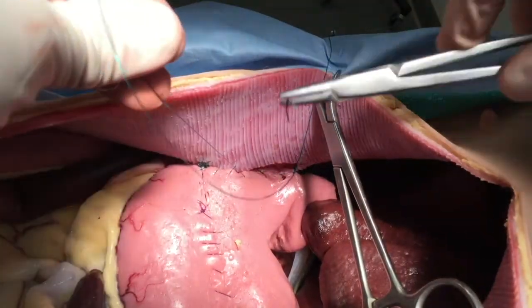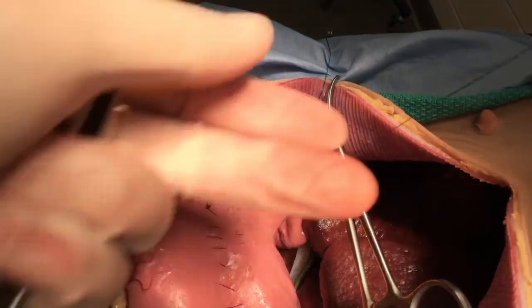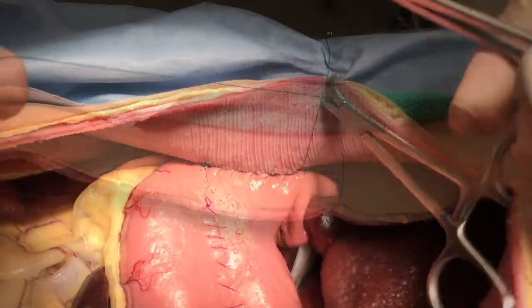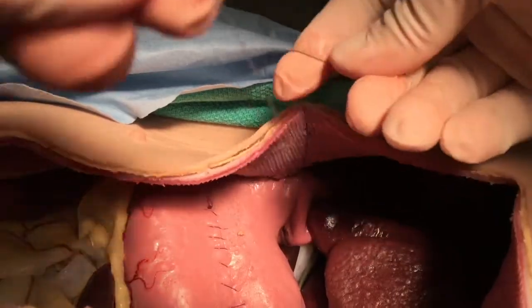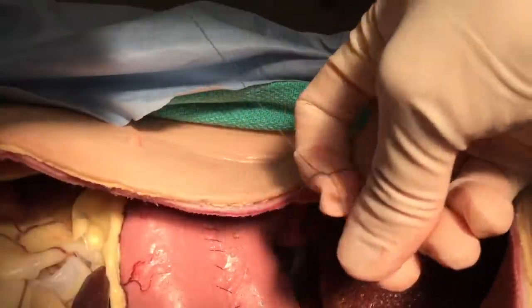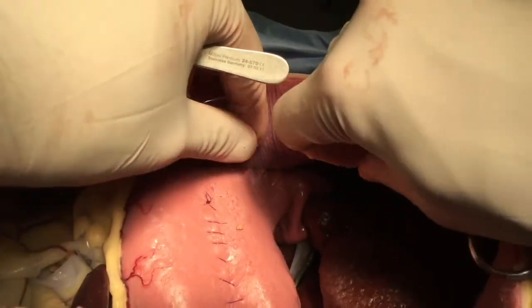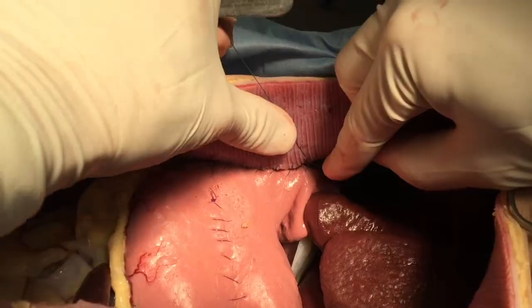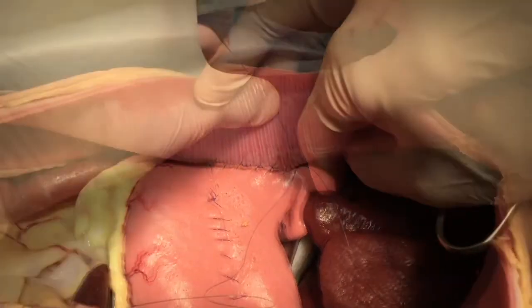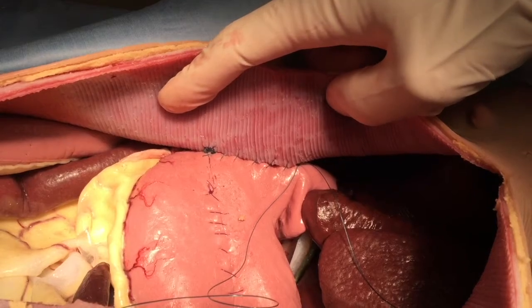Because you left that first short strand intact, these two suture strands can be tied to each other, thereby completing the gastropexy. With the wall in an anatomically normal position, there really should not be any excessive tension on the stomach itself.